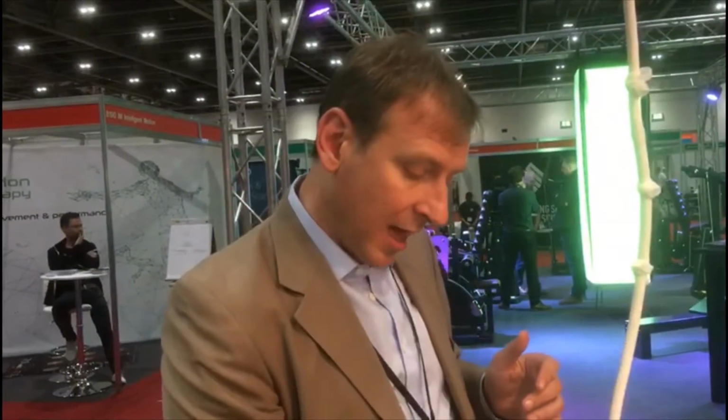Disc distraction, the IDD, you then have the capability of using the two together so that the wavelengths are actually working biologically to enhance the healing. So we're helping with reduced inflammation, which helps with the pain. We're trying to train some structures, say, with the IDD.